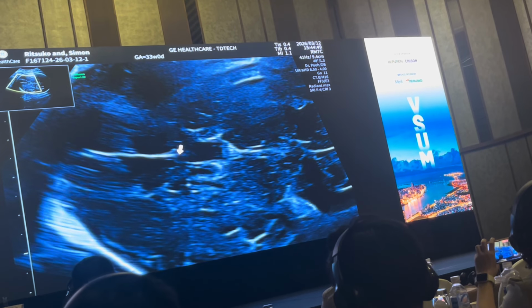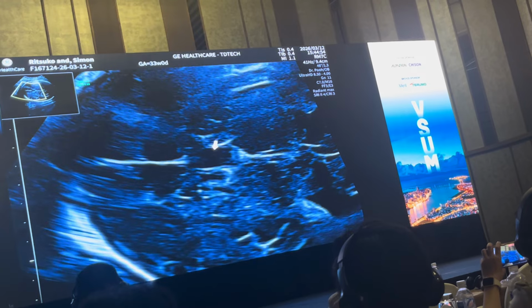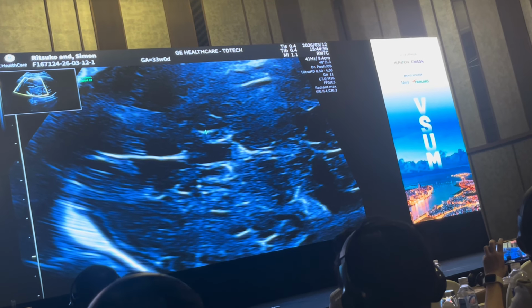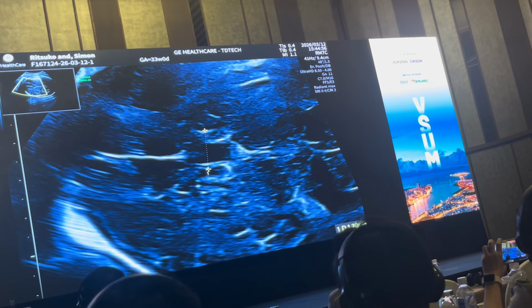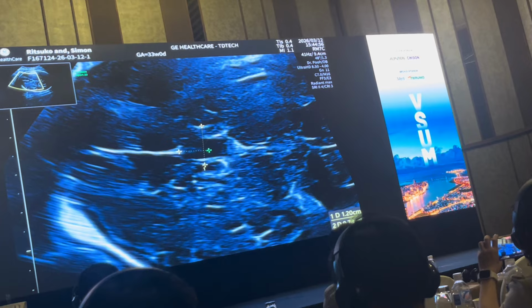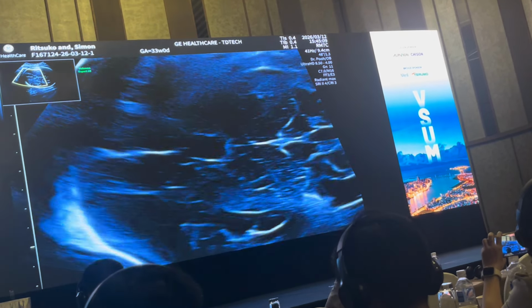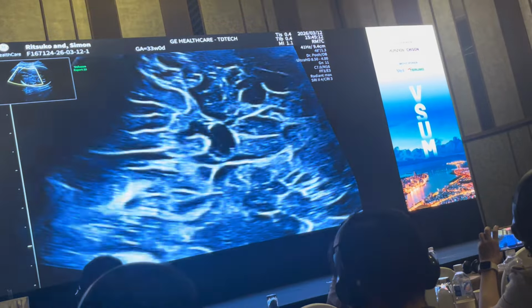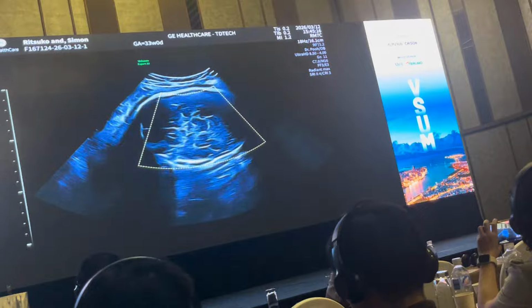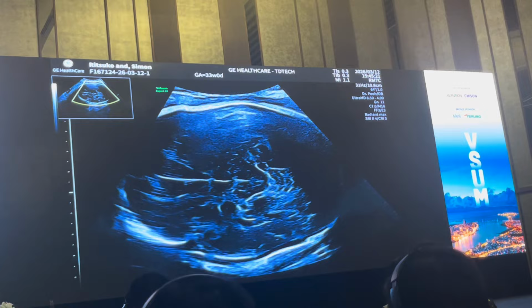It's important to recognize that the anterior-posterior diameter is longer than the transverse diameter. Because if we find that it's the other way around, that the transverse diameter is wider than the anterior-posterior diameter, would you be worried about that, and what would you be thinking? I think Nguyen is the most appropriate person. Good point. Who can answer that? Yeah, because the wider CSP. The wider CSP, the huge.